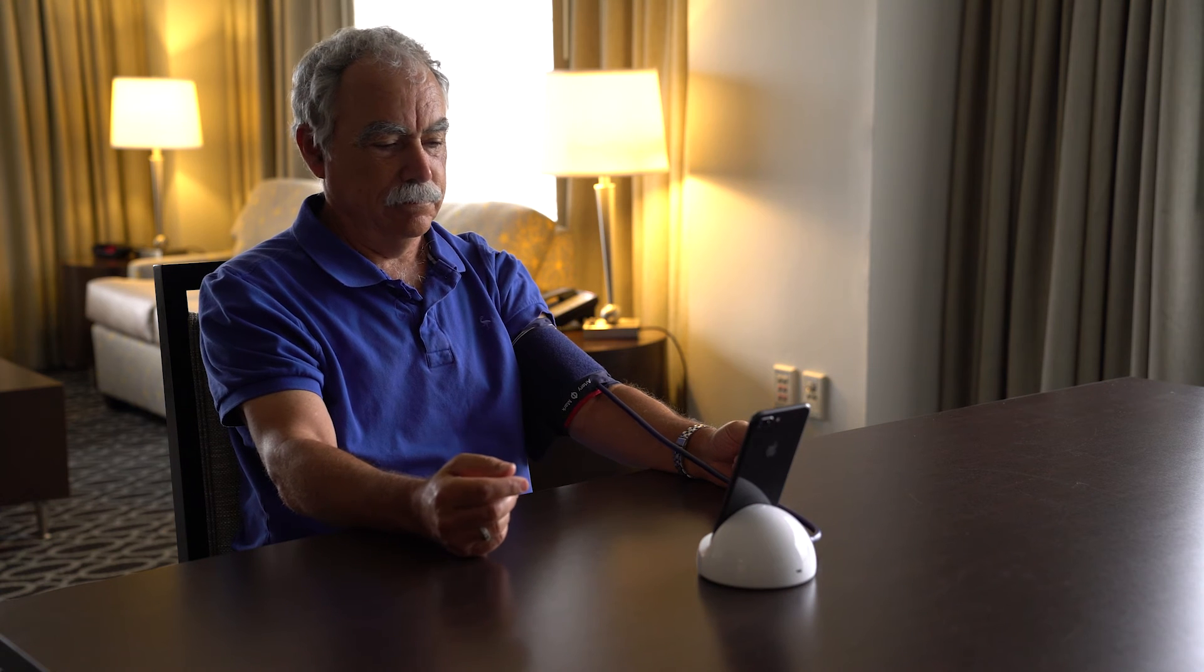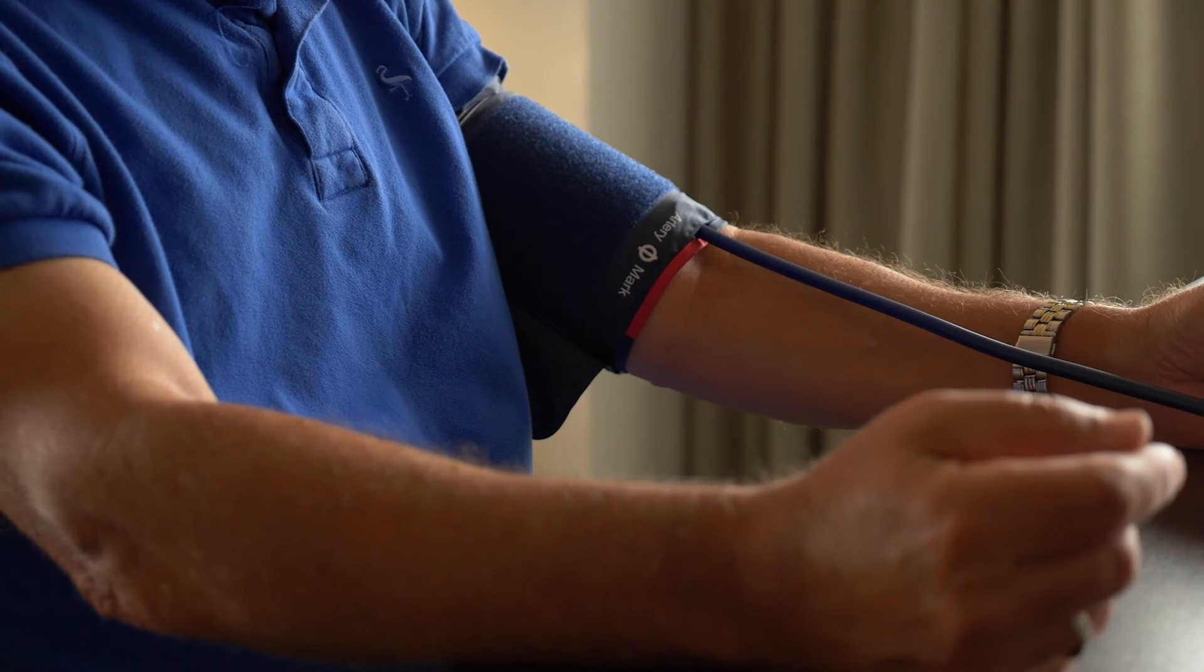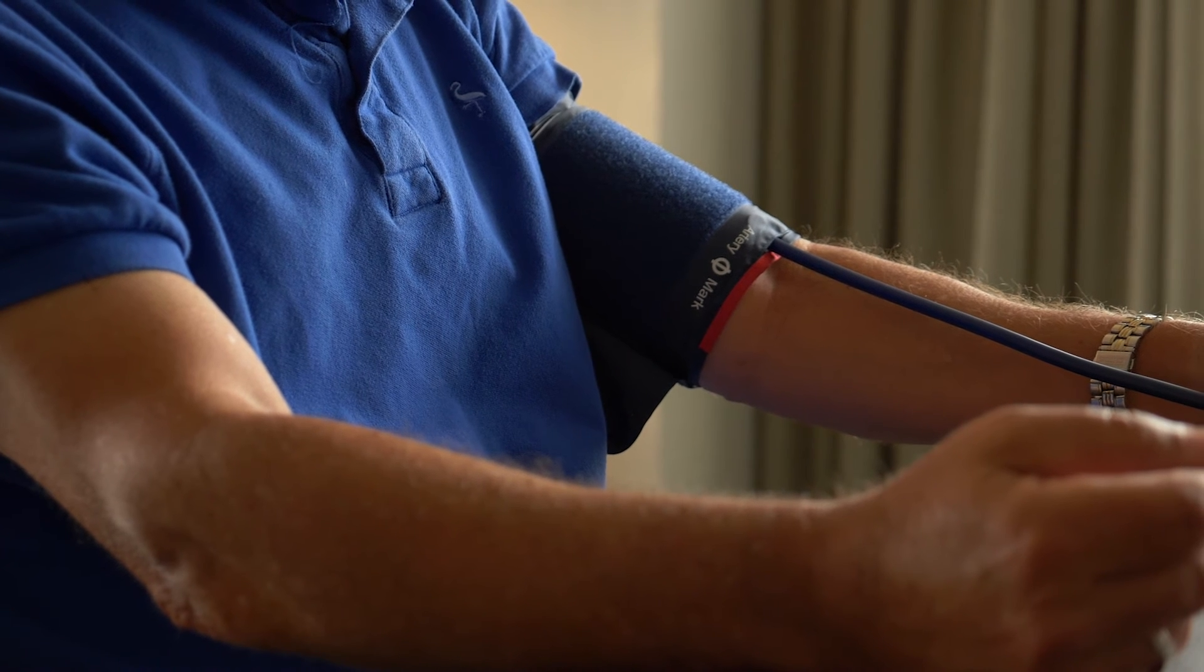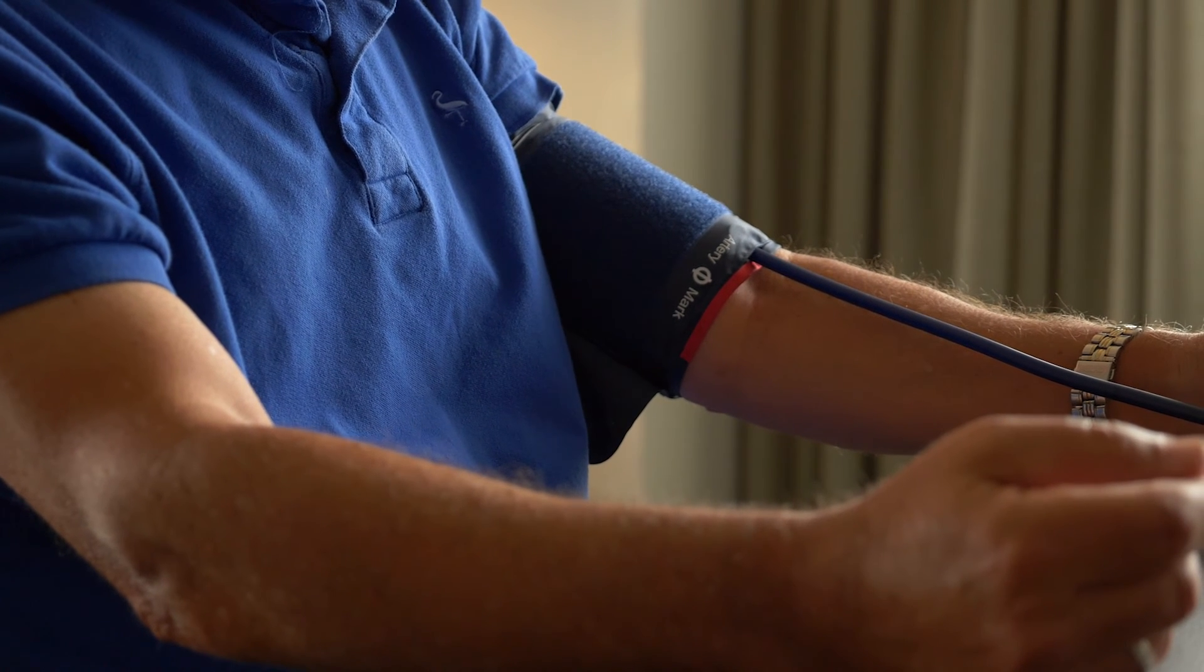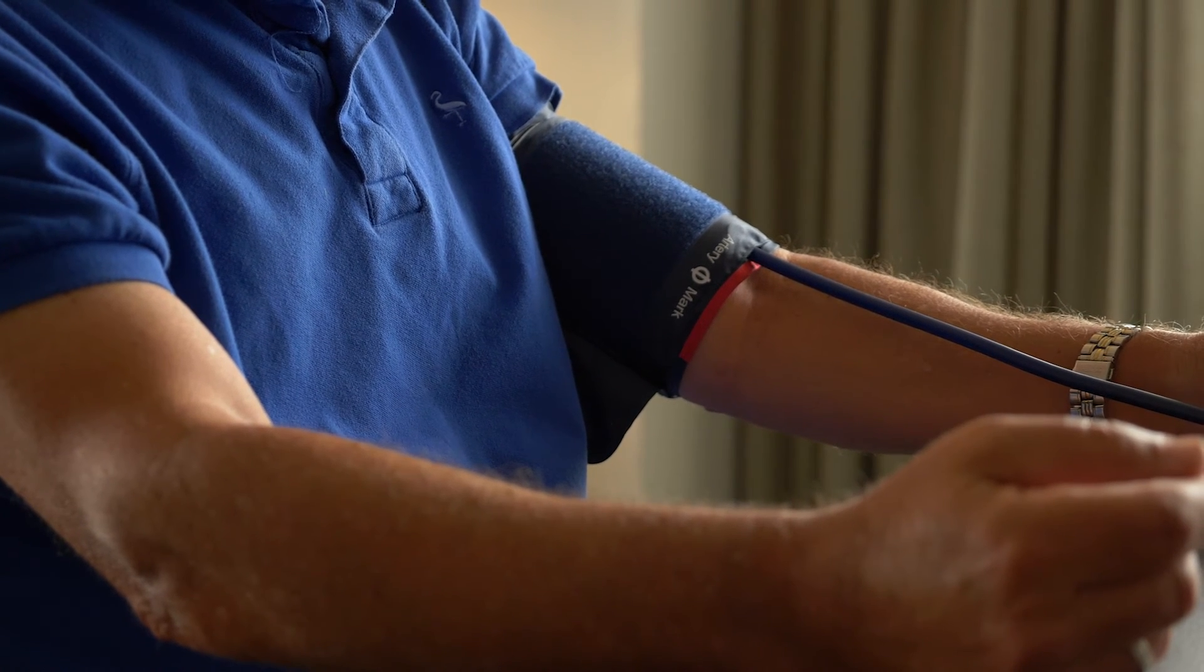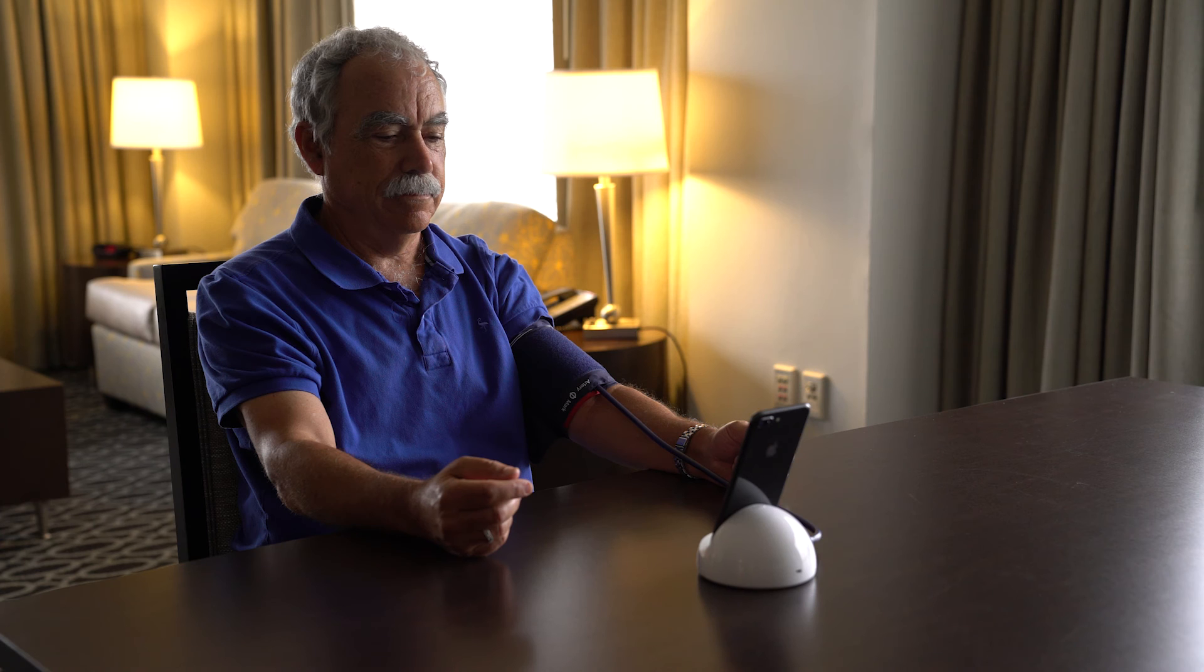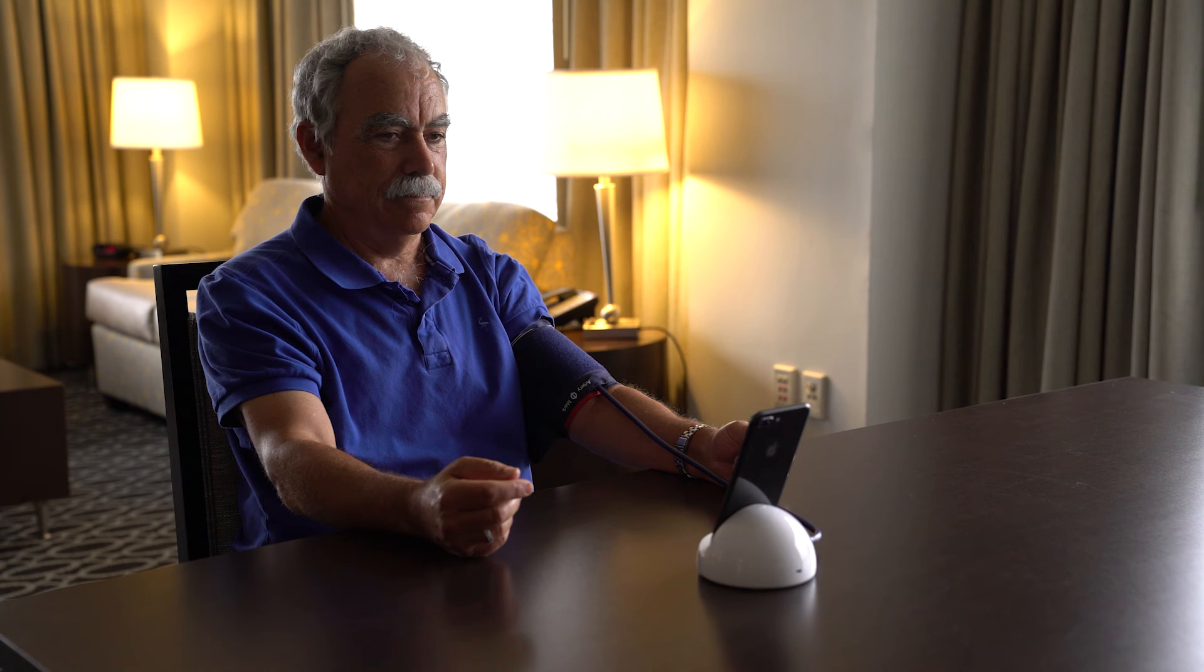Finally, tap Start in the blood pressure section of the application to start your measurement. Remain still and quiet as the machine begins measuring. The cuff will inflate then slowly deflate so the machine can take your measurement.